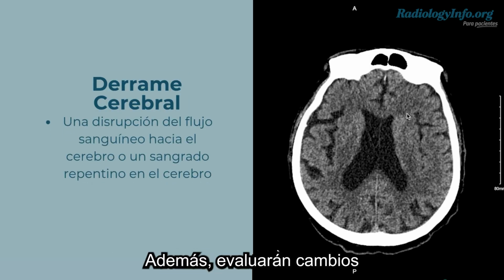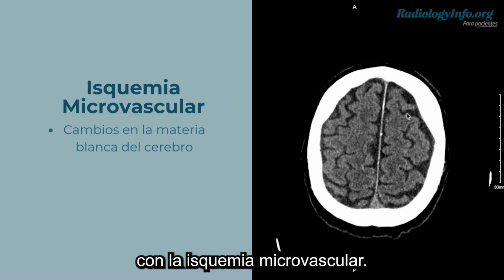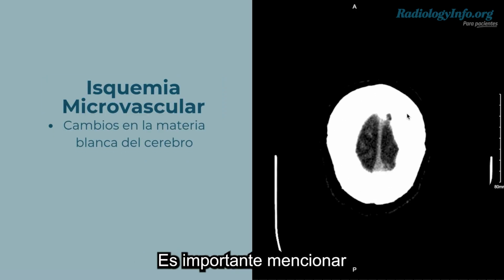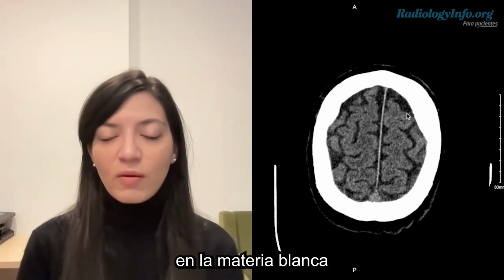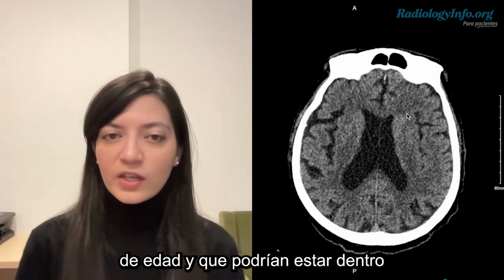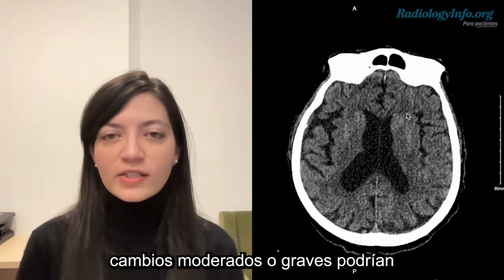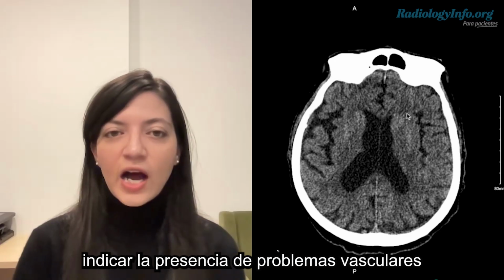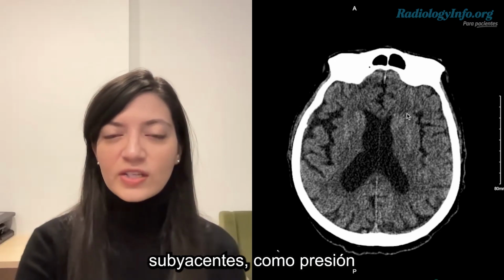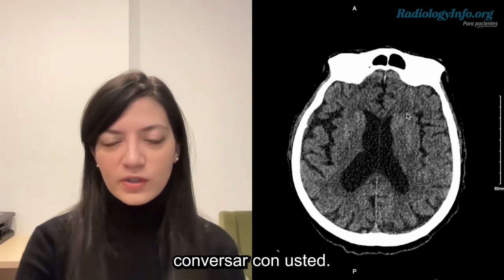Additionally, they will evaluate white matter changes, which are related to microvascular ischemia. It's important to note that the white matter changes are common in individuals over the age of 60 and may be within normal limits for your age. However, moderate or severe changes could indicate underlying vascular issues, such as high blood pressure or high cholesterol, which your doctor may discuss with you.